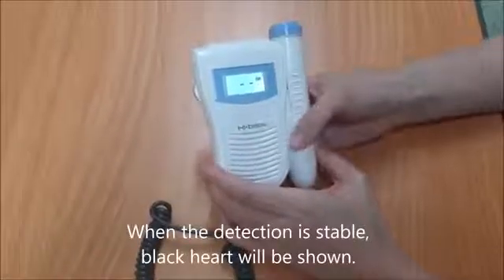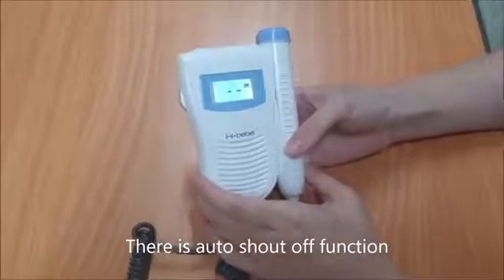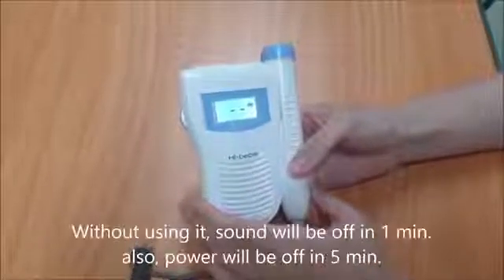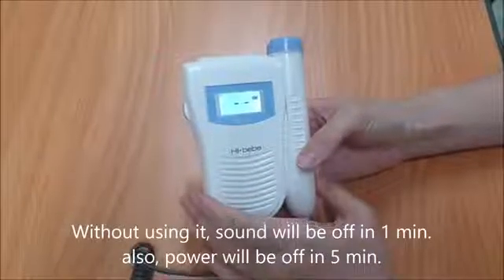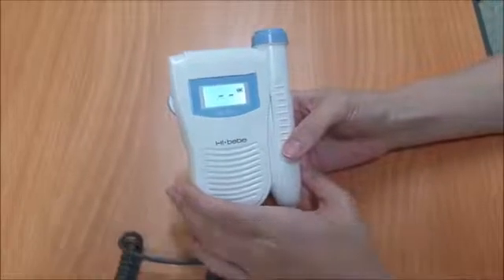When the detection is stable, a black heart will be shown. There is an auto shut-off function. Without using it, the sound will be off in 1 minute. Also, power will be off in 5 minutes.